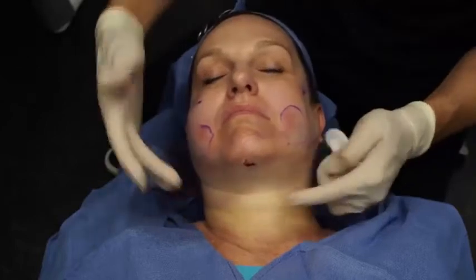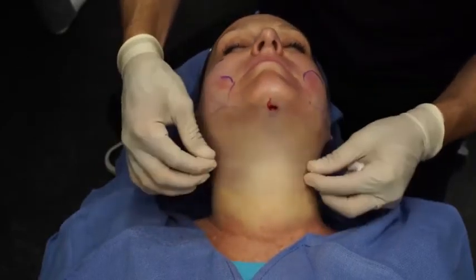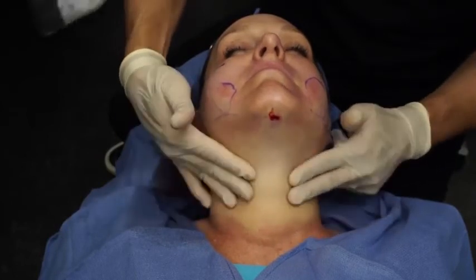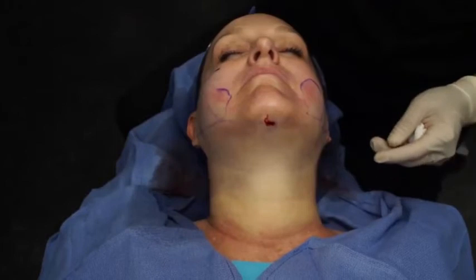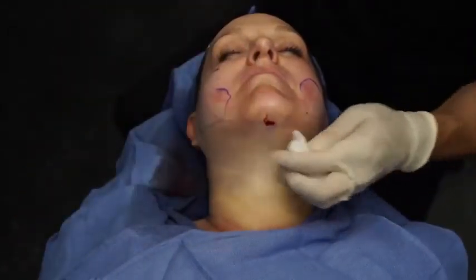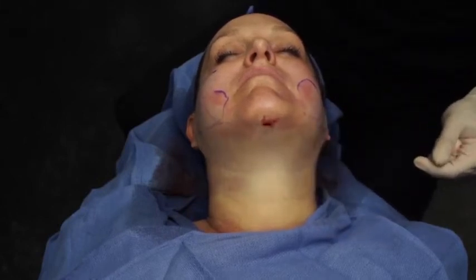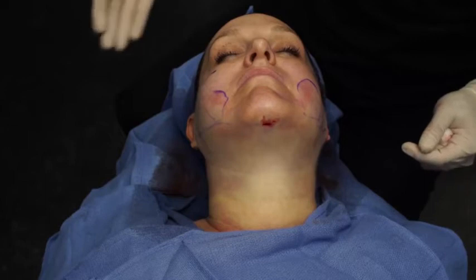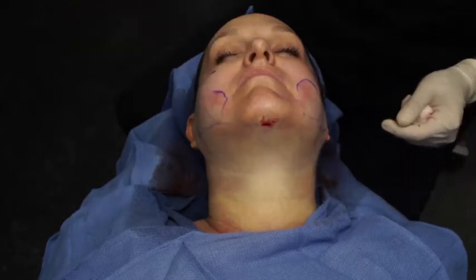All right, and so after the chin way up for me, chin way up, way up as much as you can. And so we've reached our clinical endpoint, and we're going to go ahead and wrap the patient. We don't normally suture our incisions closed, although if you do, just one suture in each port. And we don't typically put our patients on oral antibiotics. We leave the wrap on for 3 days straight, and then 2 weeks at bedtime with a very quick resolution.